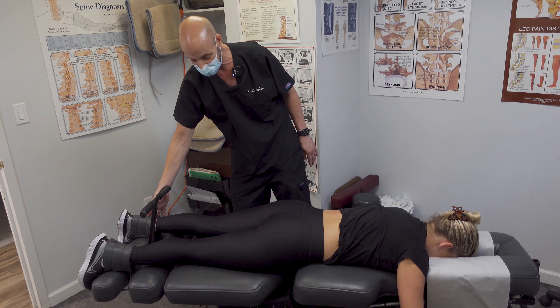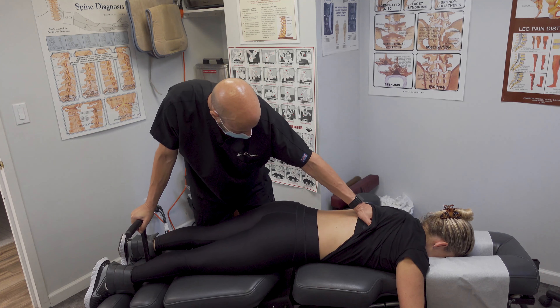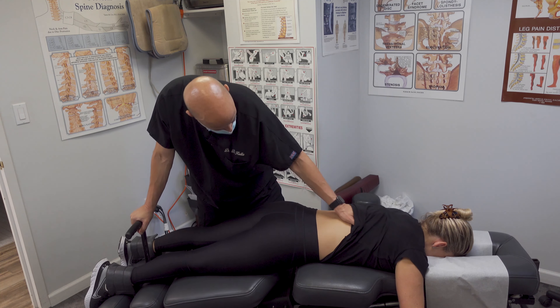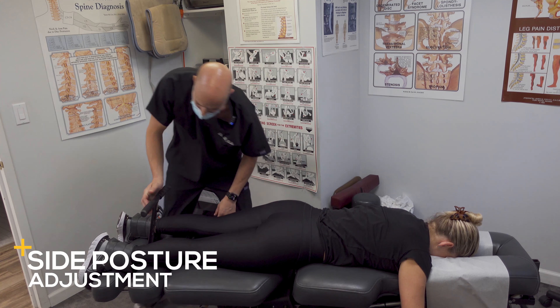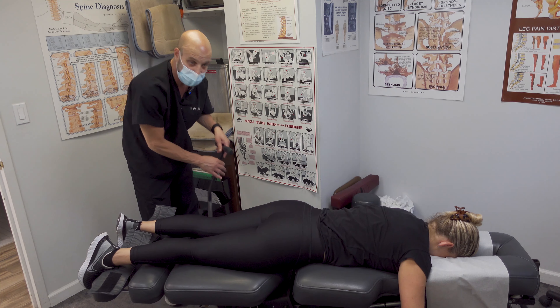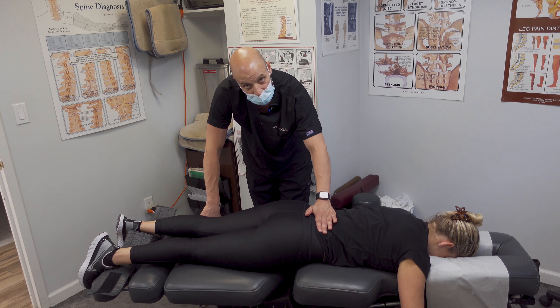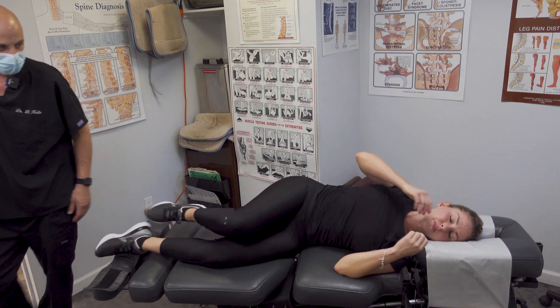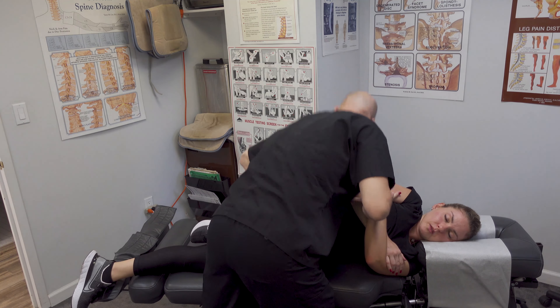I just loosened up the left side — that side tends to be much tighter for her and that hip tends to ride up, so that's why I did just the left side. How does it feel now? Looser? Okay. Then we're going to follow up with a side posture adjustment. I do not recommend doing this on every disc case — she's not acute and we've treated her a long time and she does well with a side posture adjustment. So we'll go ahead with this side up, then the other side.